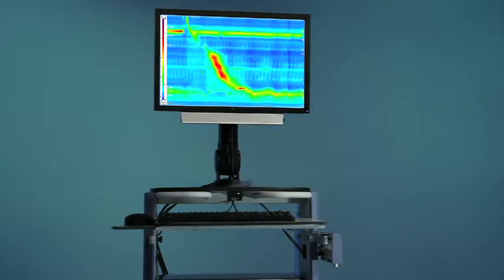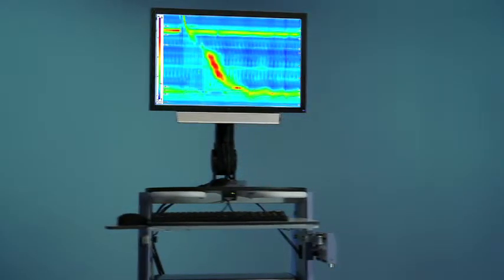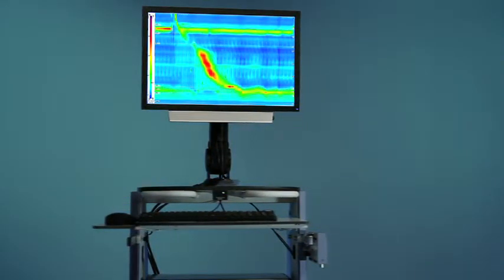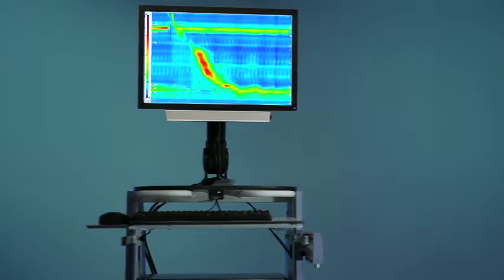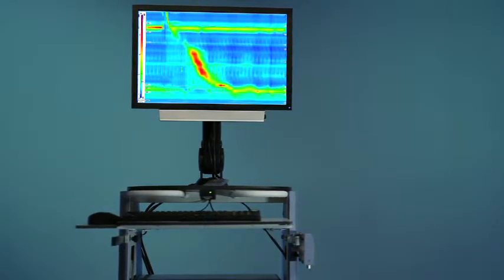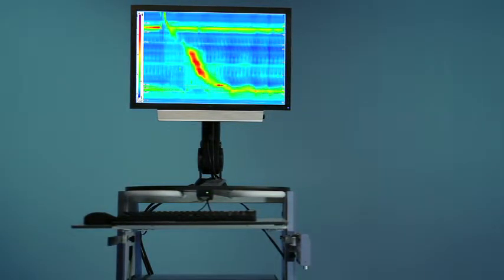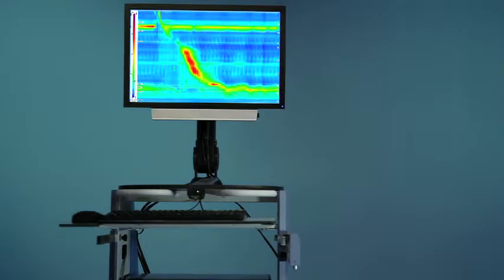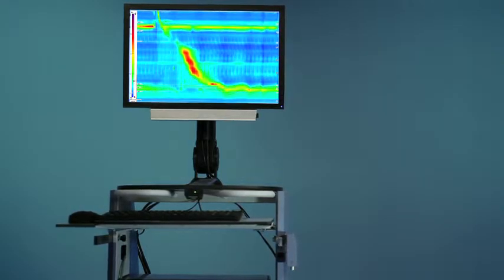Welcome to this movie on high-resolution esophageal manometry. We will show you how easy the examination is with the Solar GI HRM system of MMS.